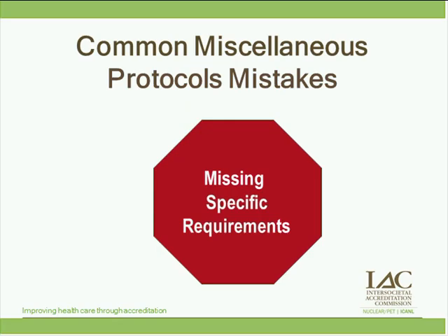The most common mistakes relevant to the miscellaneous protocols is that they are missing one of the specific requirements listed in the standards. In particular, facilities submit incomplete protocols for the administration of radiopharmaceuticals to patients about 15% to 20% of the time. There are examples of all these protocols listed on our website, and facilities are encouraged to customize them to meet the practices performed in their laboratory.